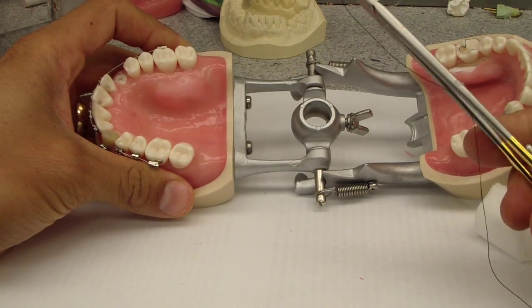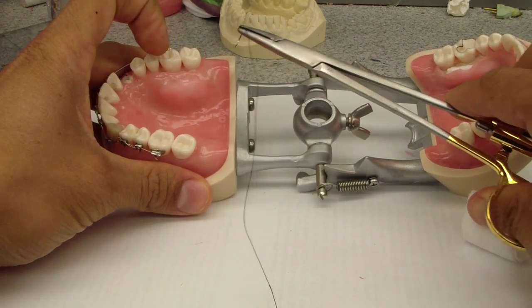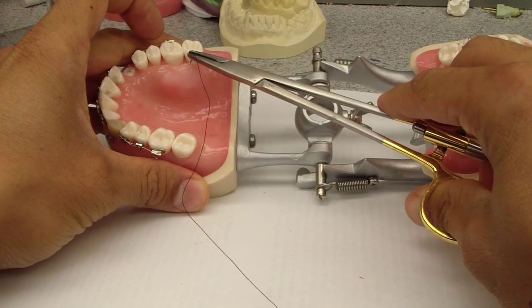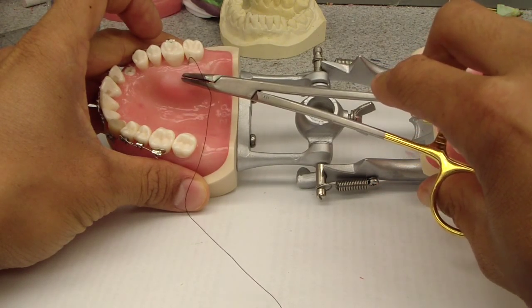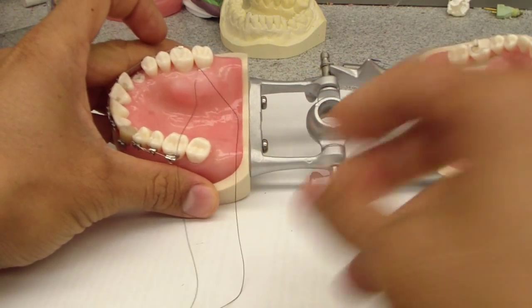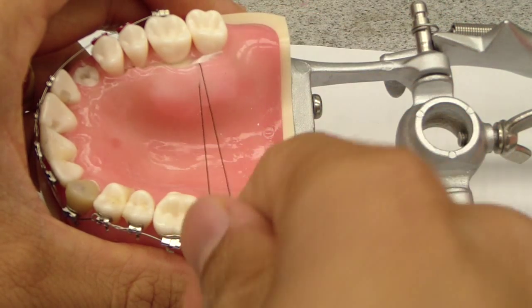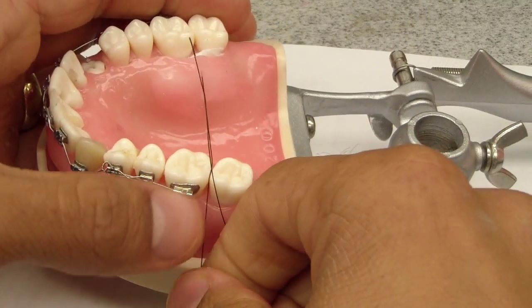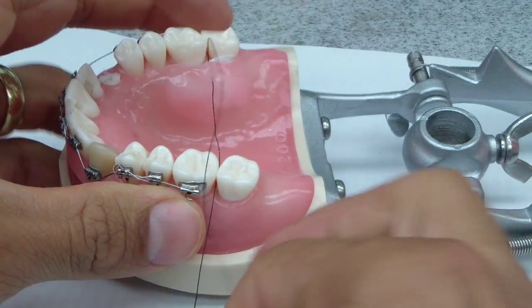Dr. Insaney was discussing another technique with me, which was just using — especially on the palatal, and you could do this on the lingual, though it's a little tough on the tongue — just placing a suture through the palatal tissue. Then you can either leave it like this and have an assistant pull, or you can knot it off and anchor it on the opposing arch or the adjacent arch.